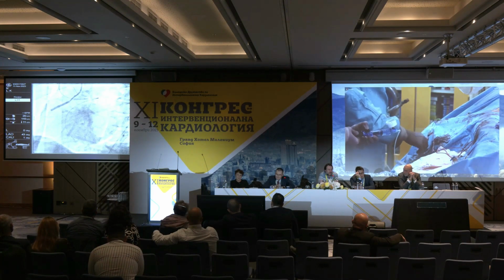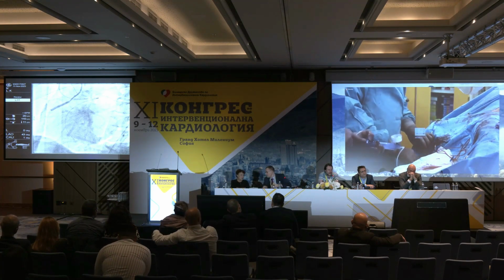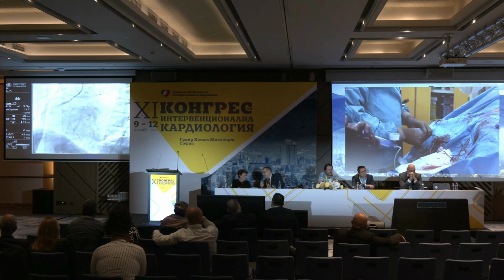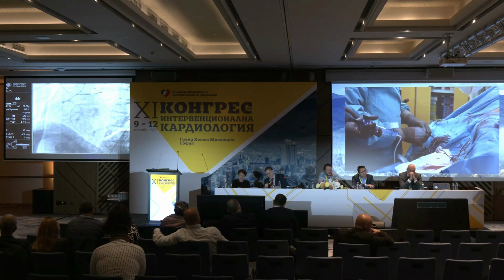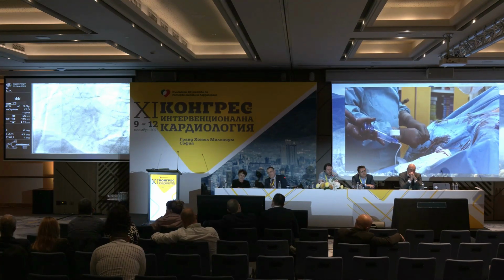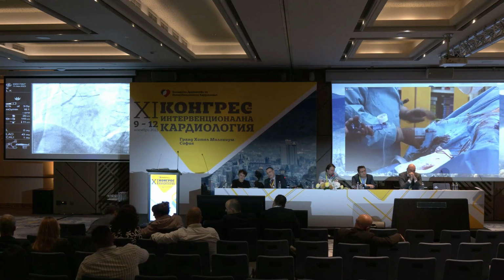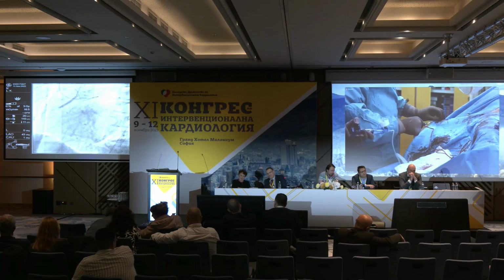So what I was suggesting was that we inflate the stent in the guiding catheter with 2 atmospheres and then push the stent so your guiding catheter is out, and then you inflate further. I always like the flaring down.